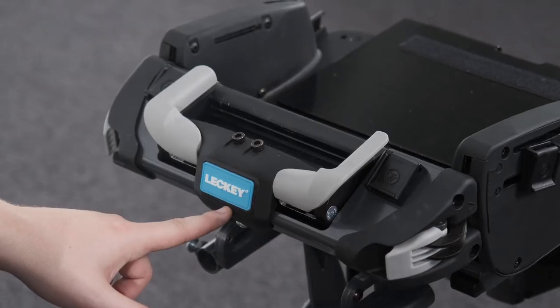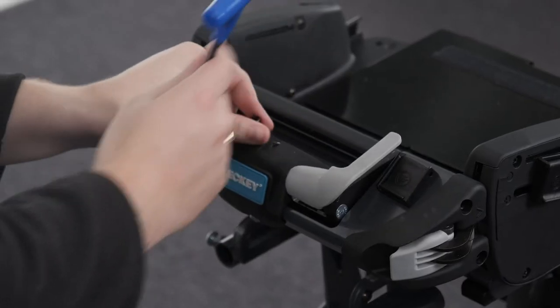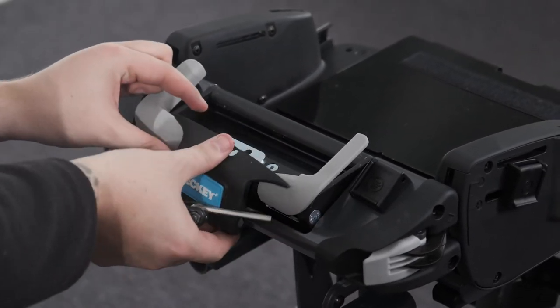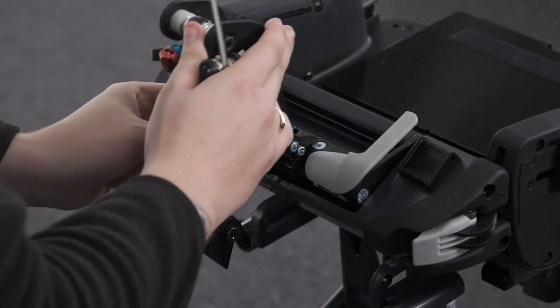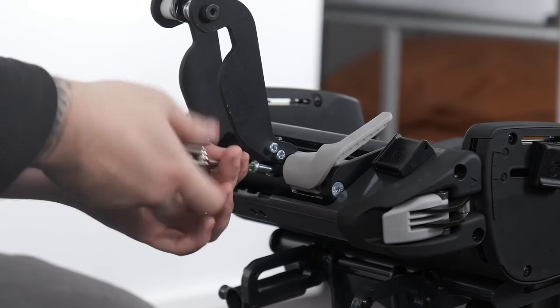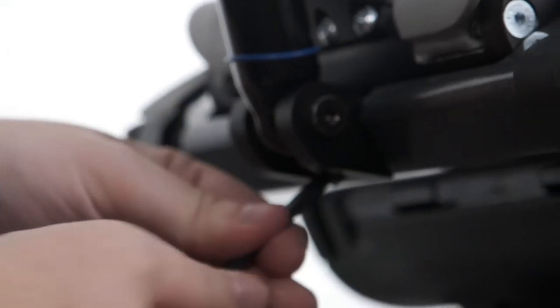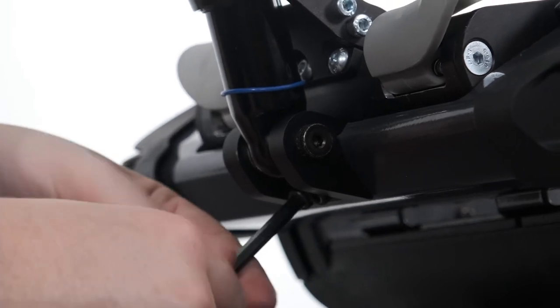Attaching the dynamic back. To attach the dynamic backrest, the static backrest plate must first be removed. Remove the two top and back bolts and remove the cover moulding. Remove the central bolt and the static backrest plate. Align the holes of the aluminium bracket of the dynamic back assembly with the holes on the seat base and secure using the five bolts provided. Rotate the dynamic back assembly around so that the holes in the aluminium block align and secure using the two bolts provided.